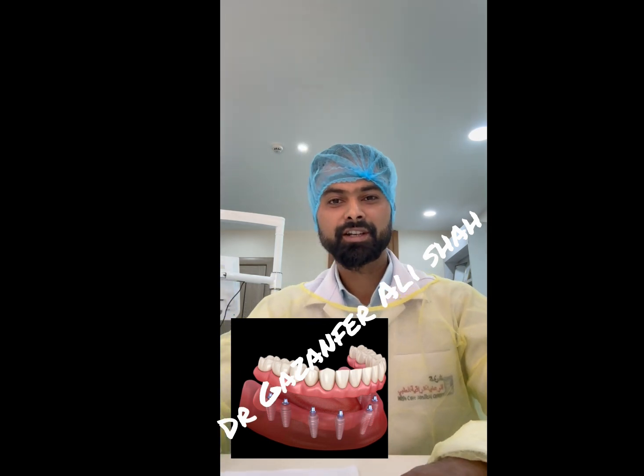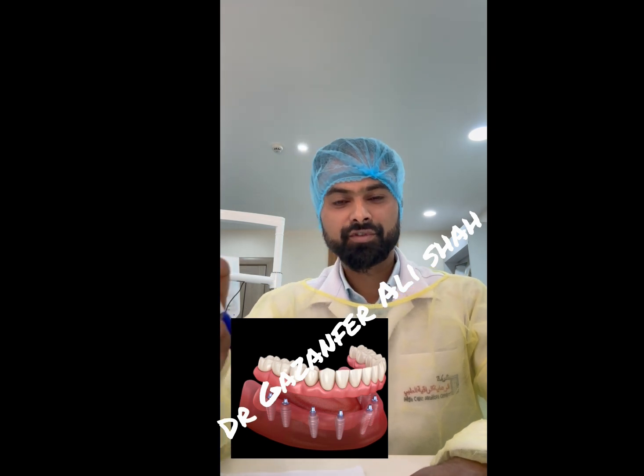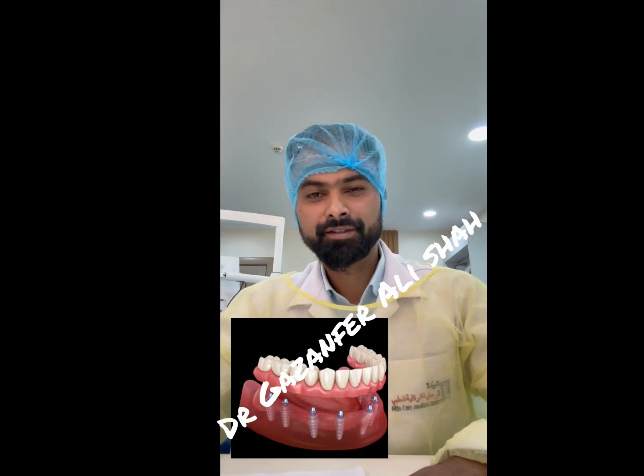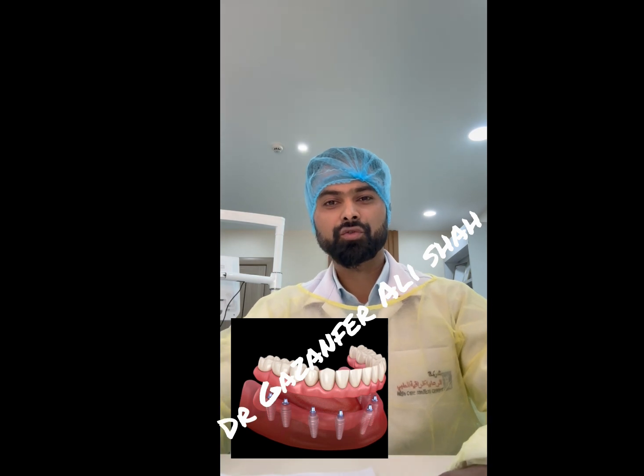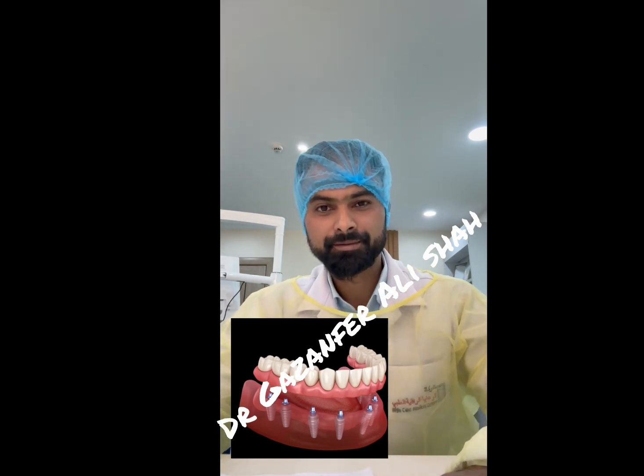So, we are placing the fixture, titanium-based screw-shaped fixtures. We are placing it in the bone and letting it heal for 4 to 5 months. And after that, we are placing the prosthetic part.